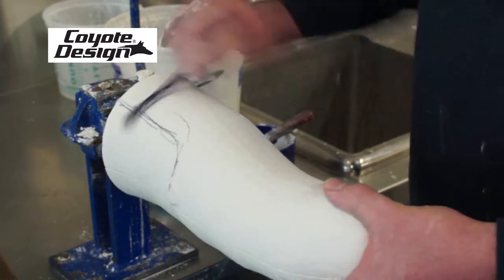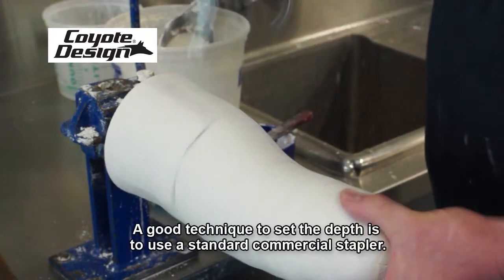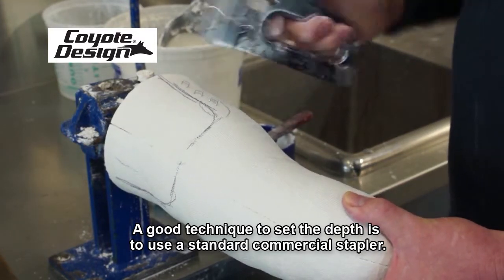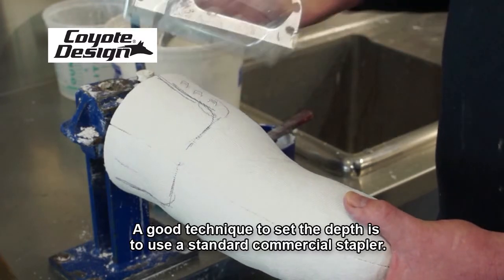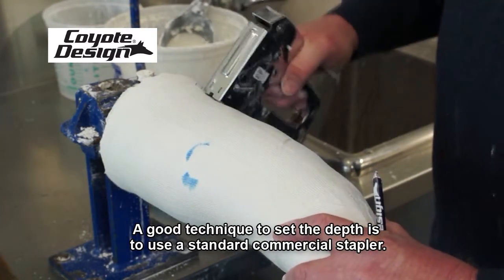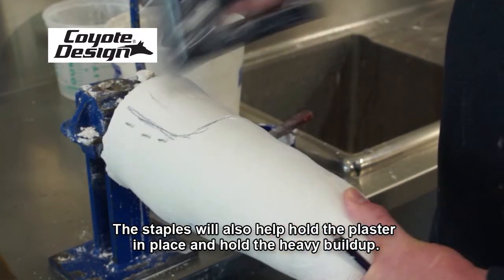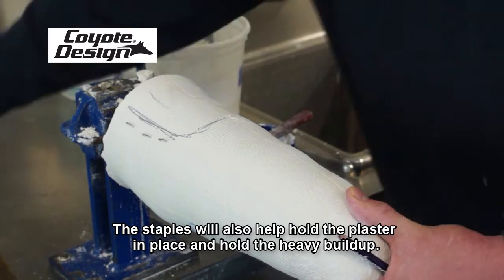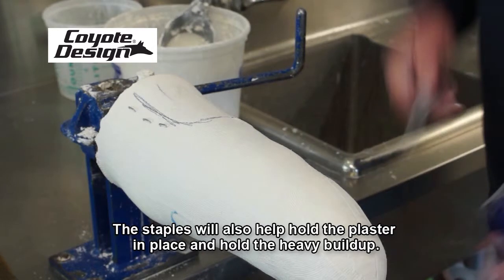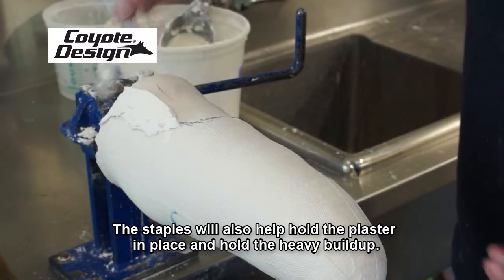These edges are sort of rolled here to anchor that plaster and also set the depth a little bit. A good technique to use is just a standard commercial stapler. In that wet plaster, the staples will bond really quickly and work to hold that plaster in place — holding that pretty heavy buildup.